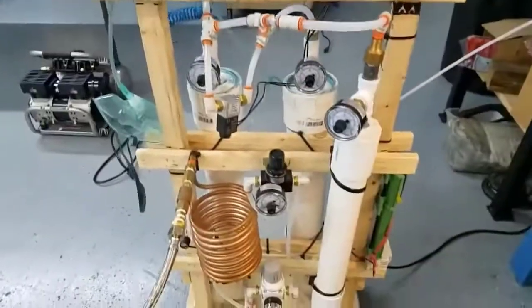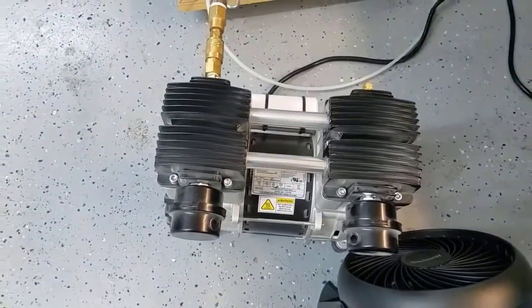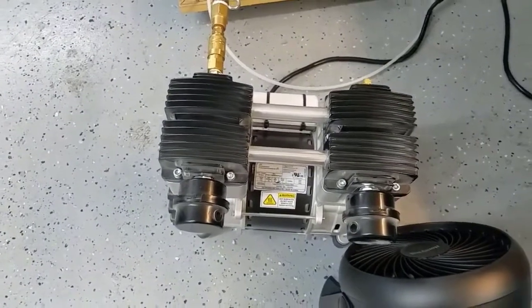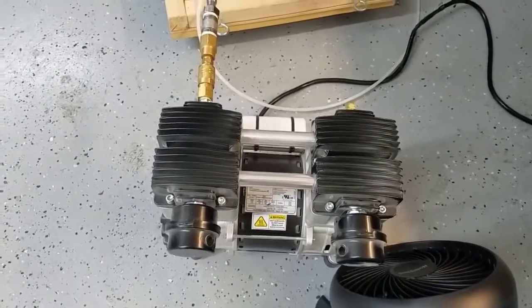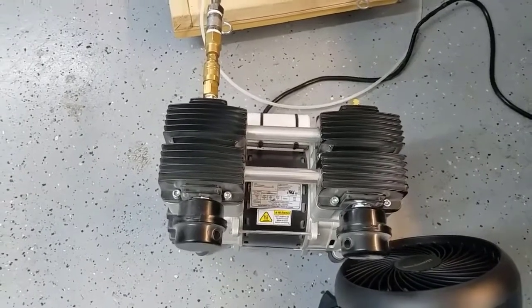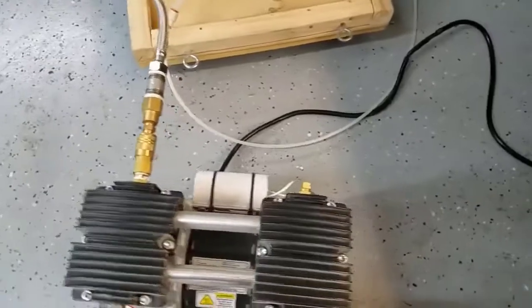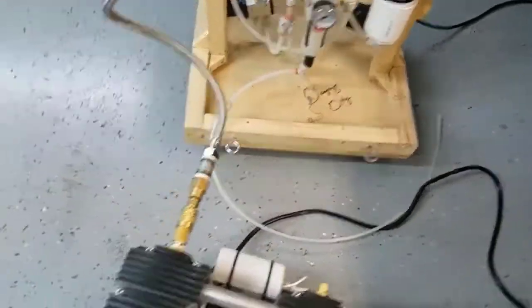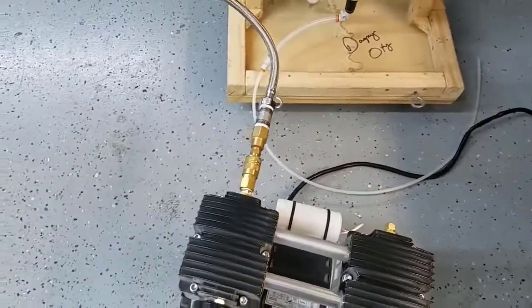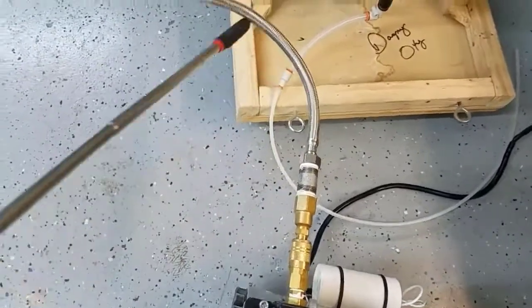This is our concentrator — this is the one that works really well. We have a compressor; this compressor is about a 2 horsepower compressor. This is how much we actually needed to get 15 liters per minute output. It is quite a hefty compressor. We're running around 30 PSI at the moment.